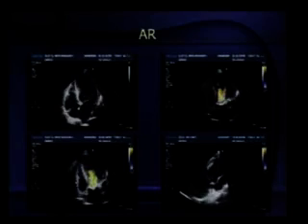Now coming back to aortic regurgitation, you have seen the parasternal long axis view, you have seen the short axis view. Because you are thinking predominantly in terms of aortic regurgitation, you will definitely have a look at the mitral valve, because mitral regurgitation, mitral stenosis and aortic regurgitation may coexist. And here is an example in which a stream of aortic regurgitation is hitting the anterior mitral leaflet, causing a flutter of the AML. You can see the jet very clearly here in the same position.